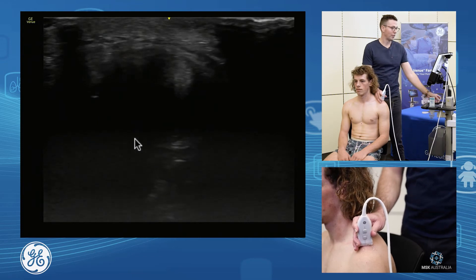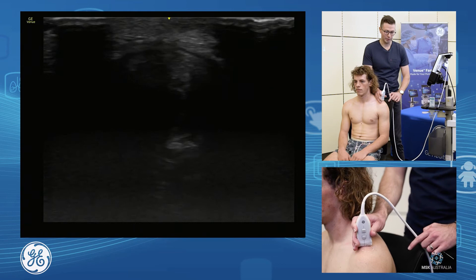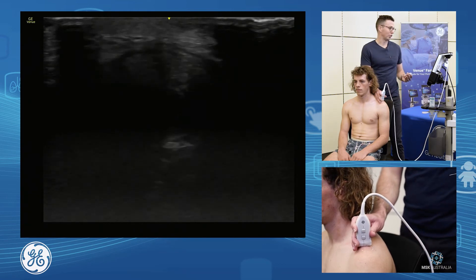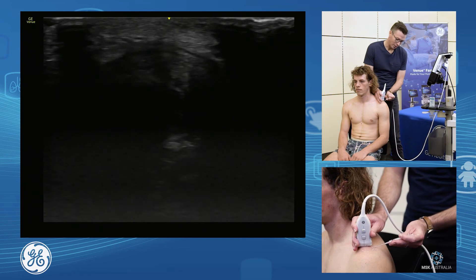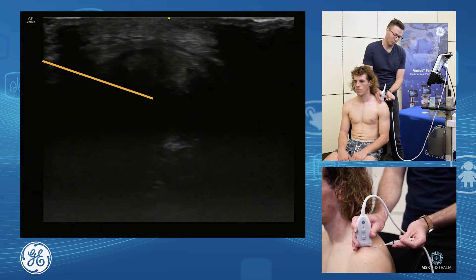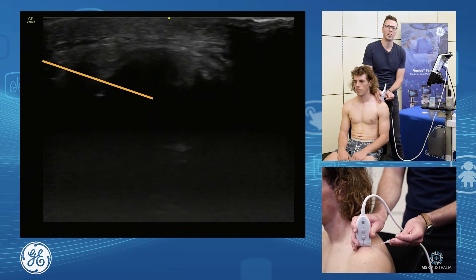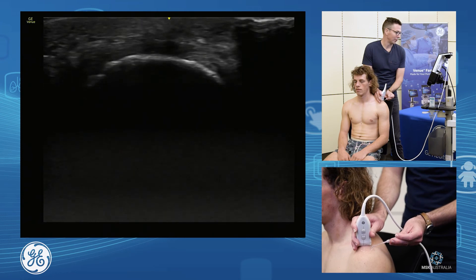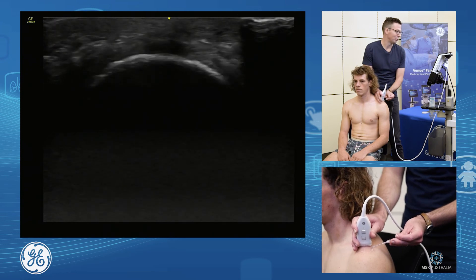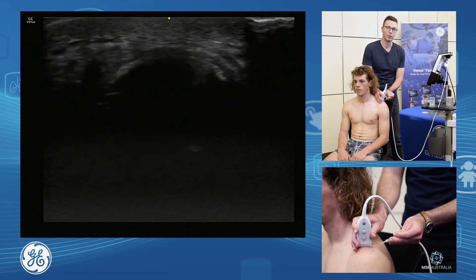We're now short axis in the joint, and this is a lovely way to do our joint injections. You'd sterilize your area, go short axis on the joint — because we know we're in the joint — and then bring your needle in from about a centimeter down, a pretty straight approach, and you get a nice little AC joint injection. A very quick and easy way to do an AC joint injection. Find your clavicle, find your acromion in the middle, see the joint in short axis, drop your needle in.